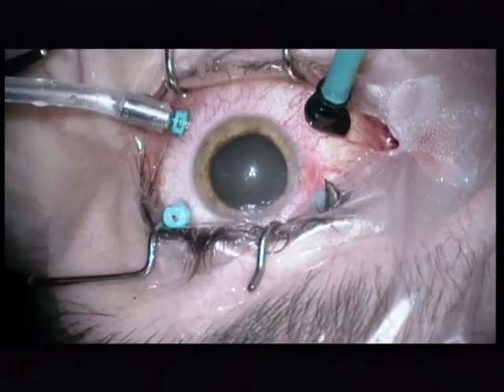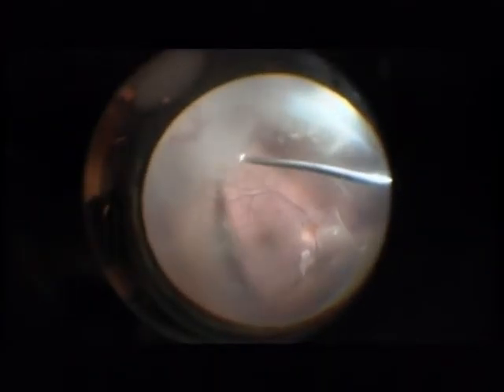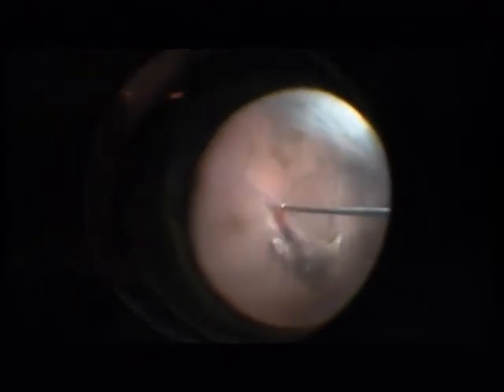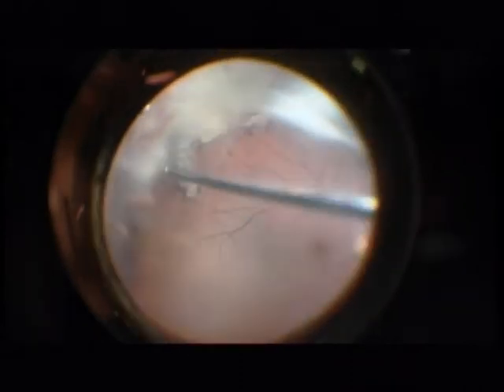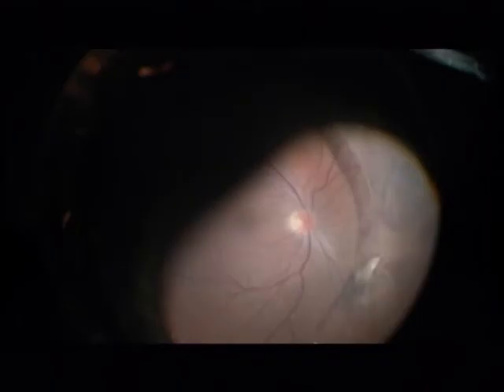The setup for this vitrectomy is 25 gauge Alcon Constellation with a Synergetix Chandelier light. Please note the dense vitreous hemorrhage with old white blood. You can see that the retina is attached and that the posterior hyaloid is partially detached, partially attached. I am inducing a posterior vitreous detachment and removing the old hemorrhage. This is three to four weeks after perforation.